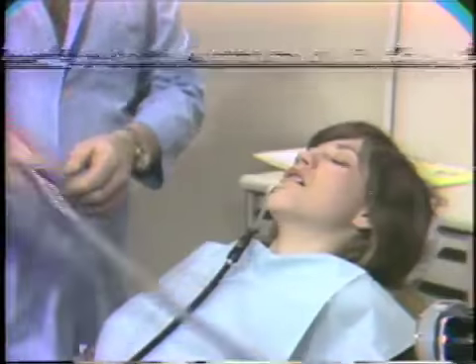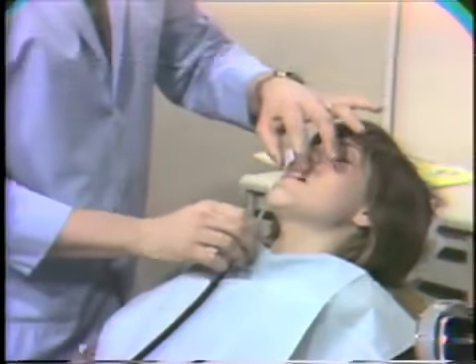Now the next thing I'm going to do is to take some intraoral photographs at the beginning of this sequence. Now we'll put some lip retractors on Carolyn. That's fine, there's one. There's another one. Now bring up 2 hands and just, oops, we got your bottom teeth there. Okay, now bring up your hands and just hold on to there. Close down a little bit.